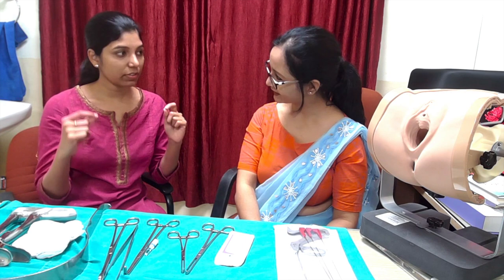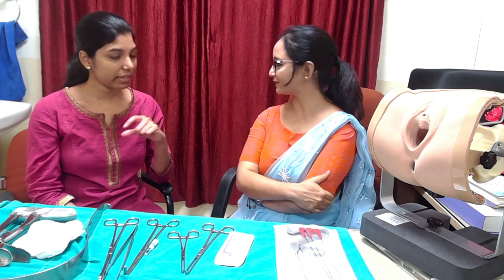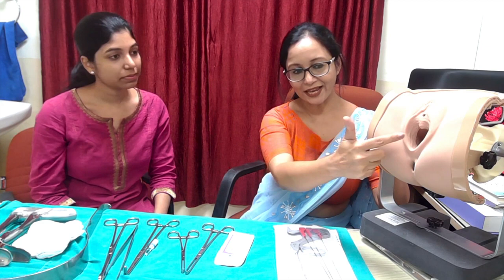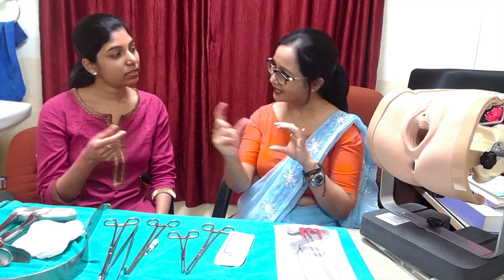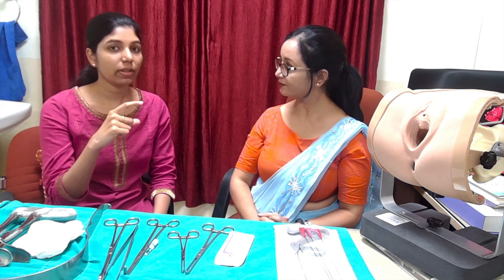Then we can see the posterior wall of the vagina, which we divide into three parts: upper one-third, middle one-third, and lower one-third. The upper one-third leads directly into the peritoneum — that is the pouch of Douglas. The lower one-third is near the rectum, so we must be careful. The middle one-third is where we actually give the incision.